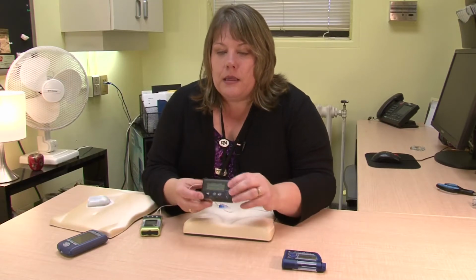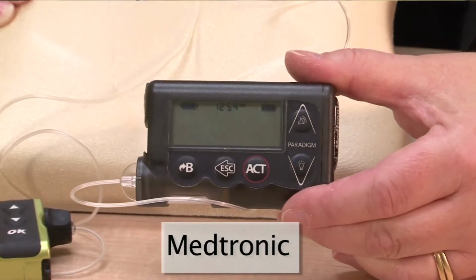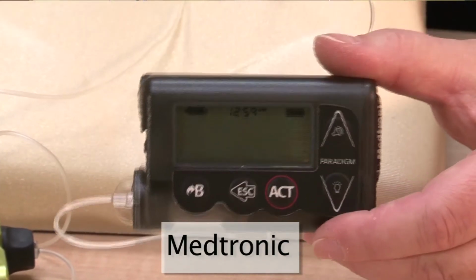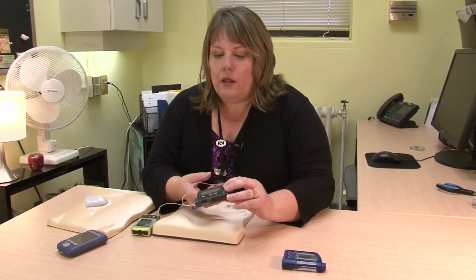Third pump, the Medtronic pump. This one is a black pump. It could be clear, it could be purple, it could be blue, it could be different colors, but generally it's going to look the same. Same thing with this one. It has a tubing. It's going to attach onto the body in all the same locations. It's going to as well have an option of various lengths of tubing.